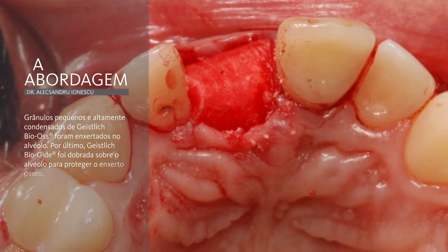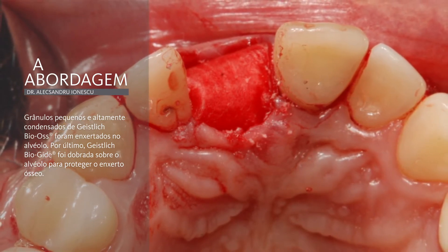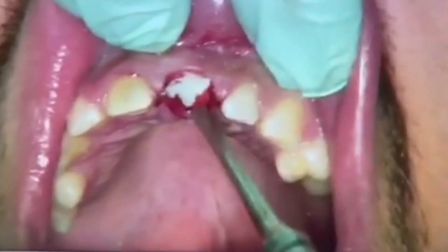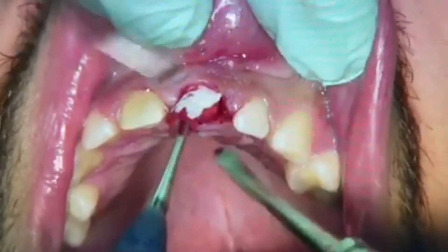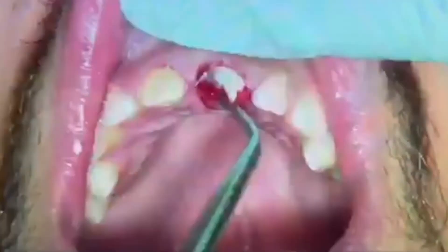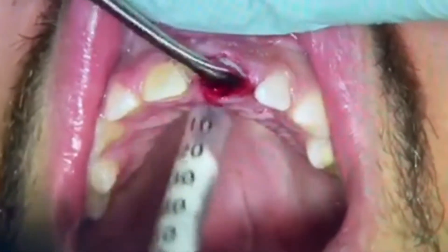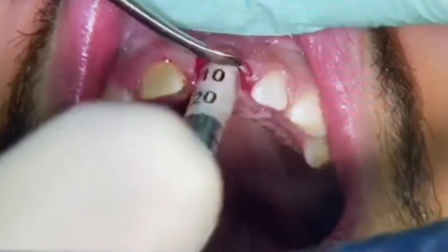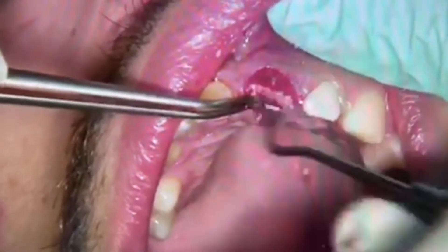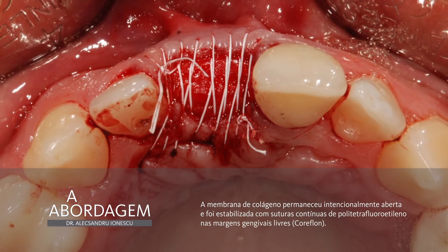Finally, the Bioguide membrane was folded over to protect the bone graft and remained deliberately open. Here is a short movie showing the previously described steps: the shaped membrane inserted deeply into the alveola, the Geistlich Bio-Oss small granules highly condensed to fix the membrane in the apical region, and the membrane folded to protect the bone graft. After folding the membrane, a PTFE continuous suture at the free gingival margin was performed to stabilize it.